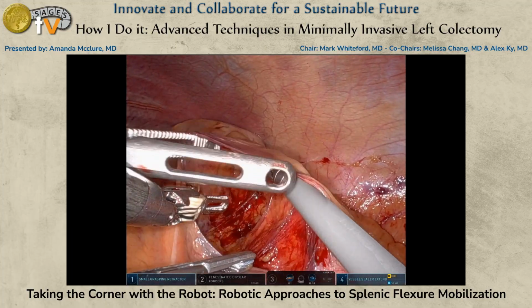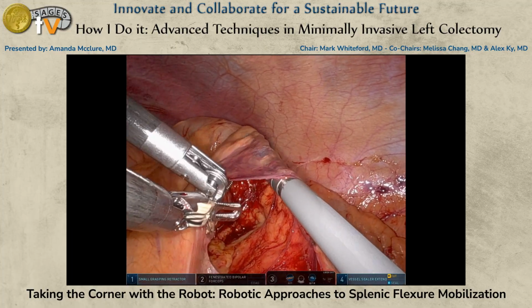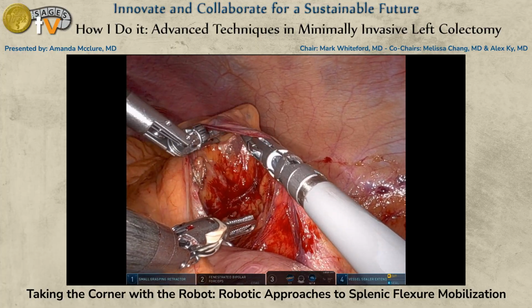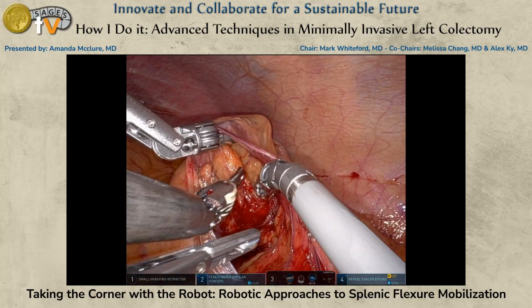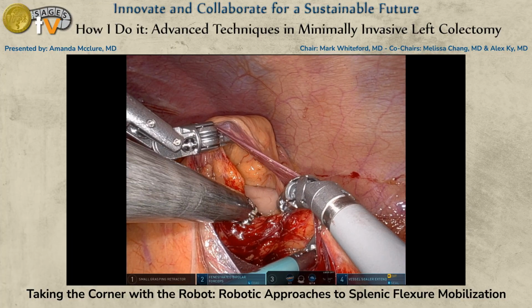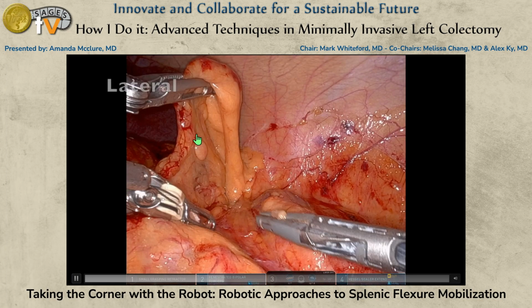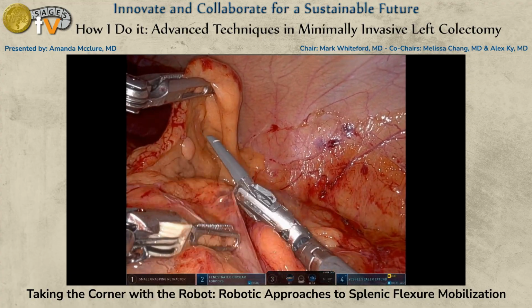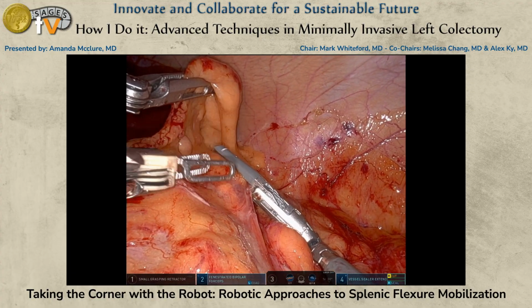Here we see stomach coming up, and so a lot of times, if I'm struggling, I'll start medially because it's an easier dissection, and it helps you with the lateral dissection as well if you can't get retraction. A lot of the times when people have trouble, they can't pull this down. And so starting here then gives you your planes and you can continue kind of working known to unknown. And then we'll go back and complete the dissection anteriorly.